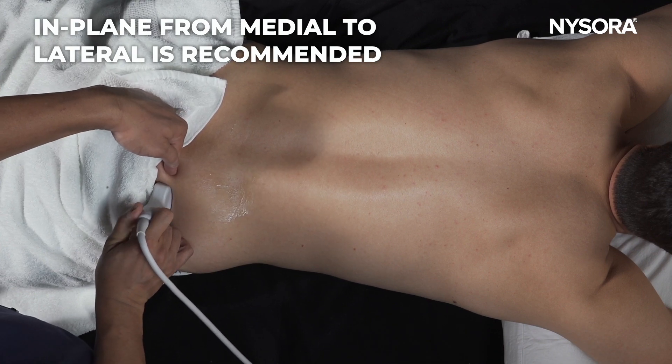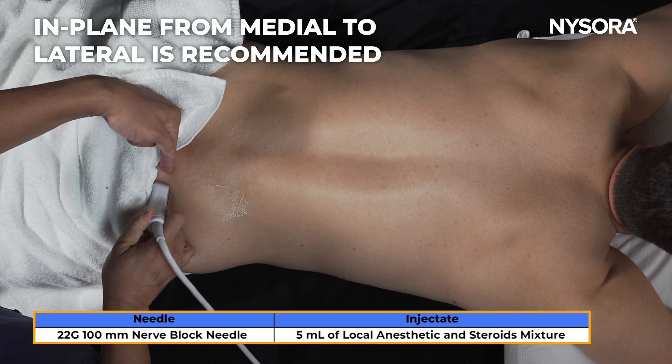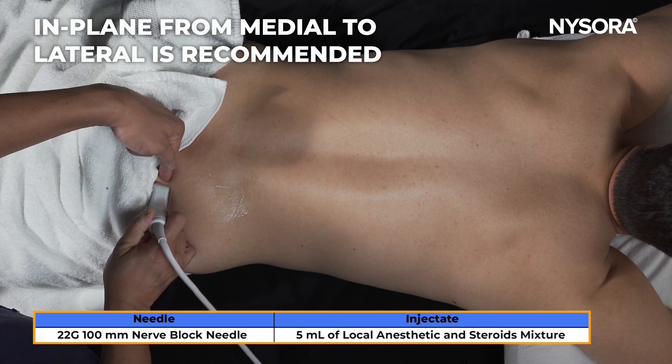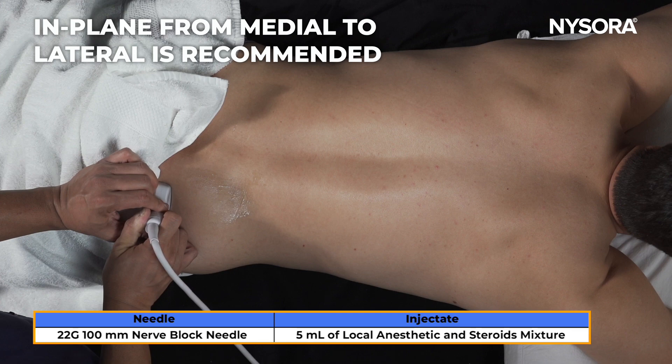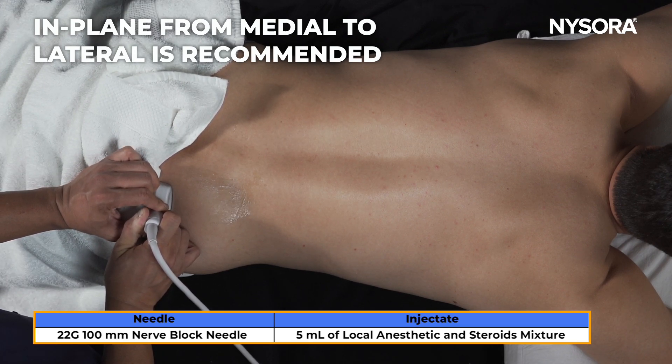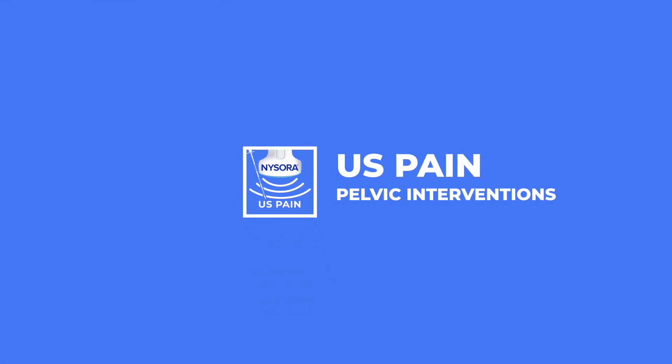I would always recommend performing an in-plane technique, because this way you can see the needle tip and avoid injury to the internal pudendal artery. I inject about five milliliters of a local anesthetic and steroid mixture to perform a pudendal nerve block.